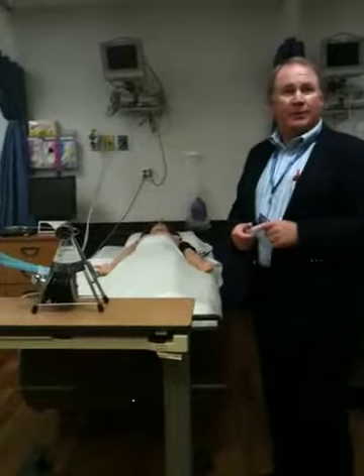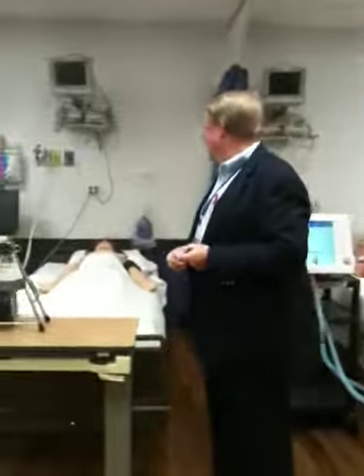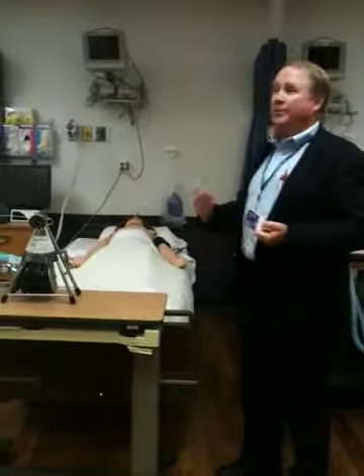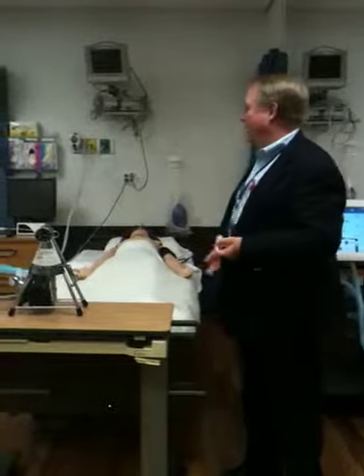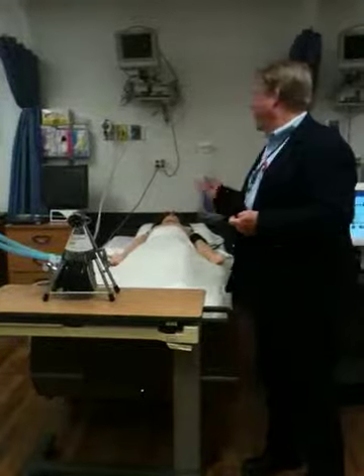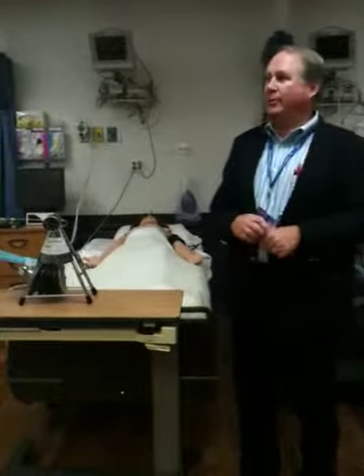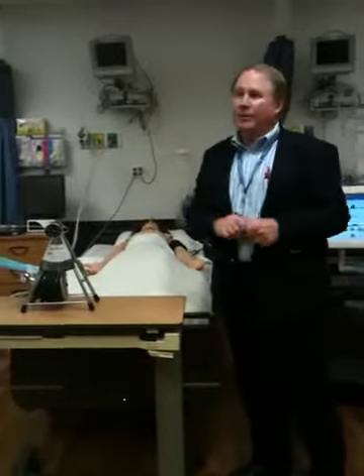This one over here doesn't look too hot. No, he's had a few problems. He can pop a pneumo. Either one of them can. They have femoral pulses, pedal pulses, posterior tibial pulses. They have carotid pulses. We don't use them for the arterials. We have 2 others, or actually 4 others. We use the arms to do brachials. These do have pulses and blood pressures, so that we'll simulate various diseases and arrhythmias with it.